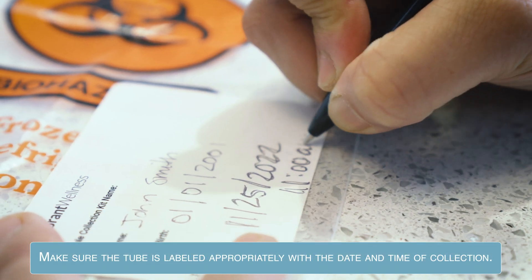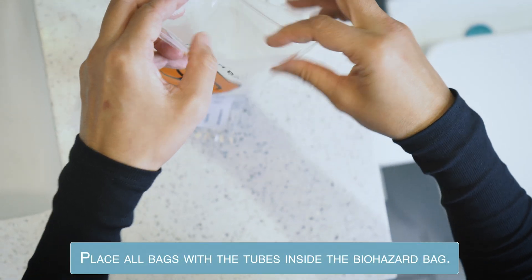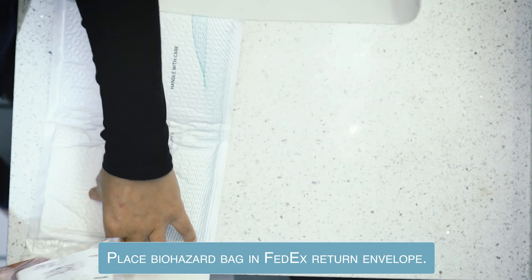Make sure the tube is labeled appropriately with the date and time of collection. Place the bag with the tube inside the biohazard bag.